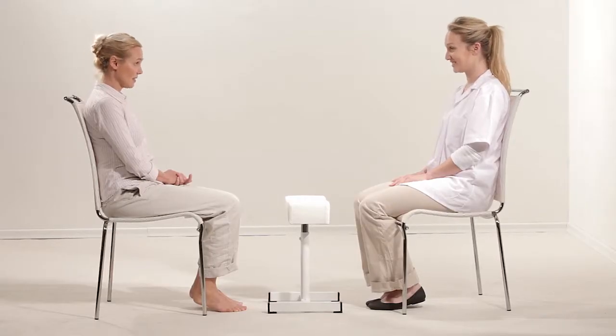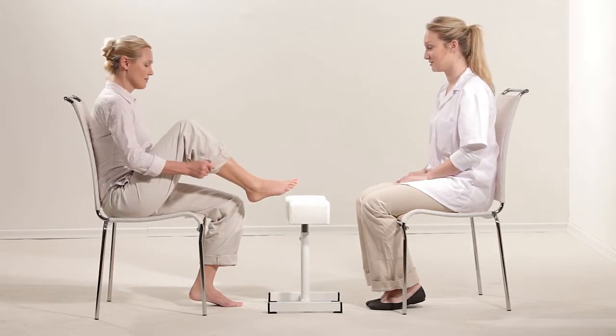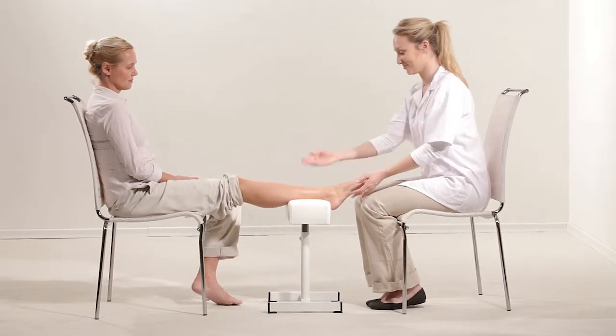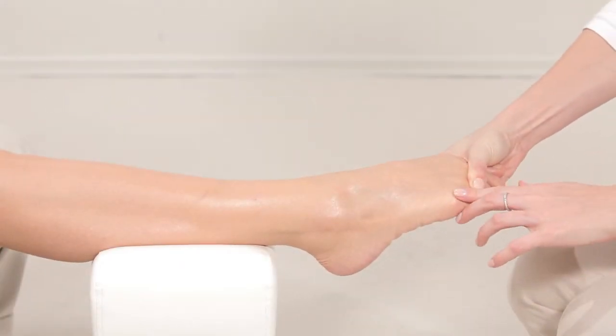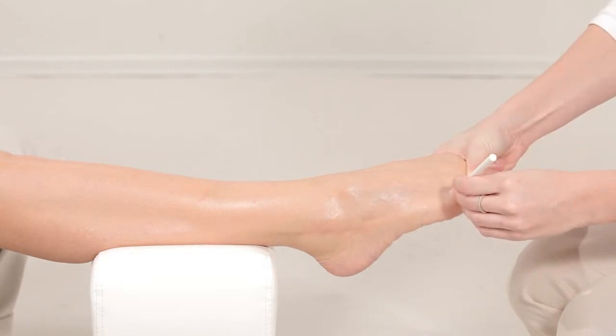To measure the fifth metatarsal, the subject should be seated opposite the operator. The non-dominant calf should be placed on the leg rest with the foot as close as possible to the operator. The subject's toes should be flexed so that the distal part of the metatarsal projects outward. Using a marker, place a dot on the proximal side of the prominence.